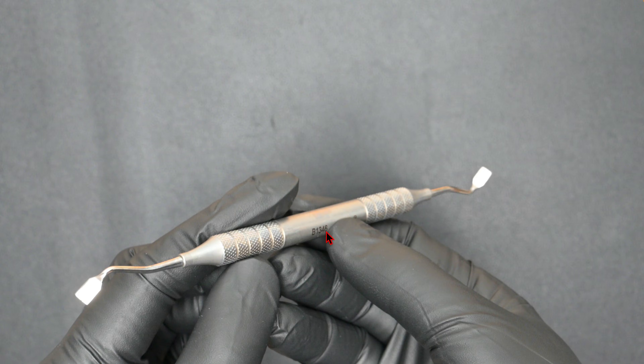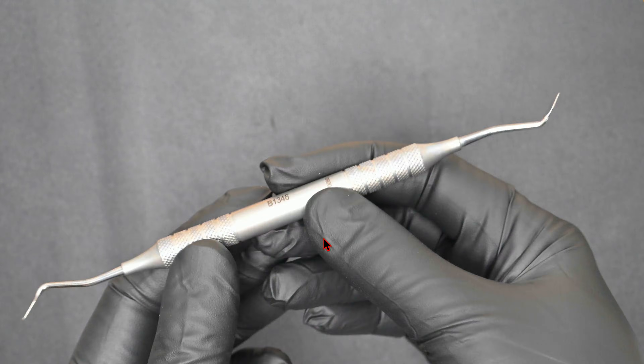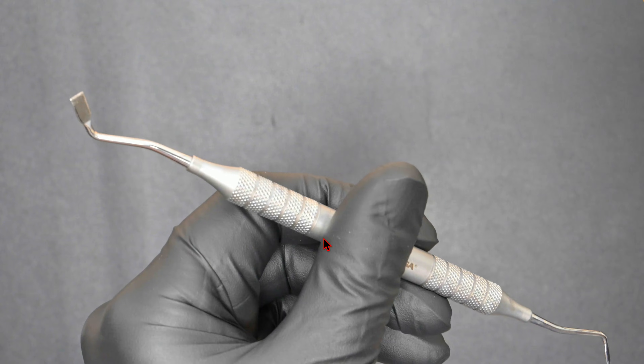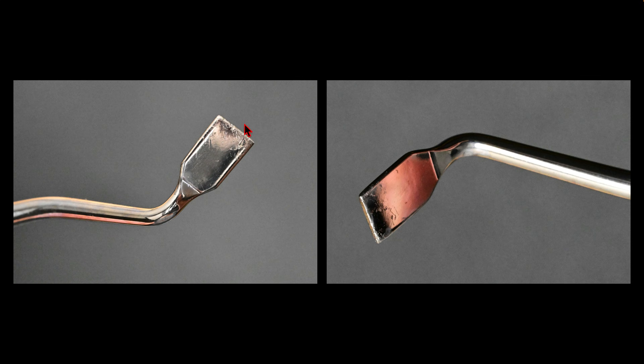Here's the instrument itself — it's a Brasler B1346. It has a really nice handle, it's not very heavy, and it's very strong and robust on the spreading sides with two different angles. These do get worn out over the years, and once you lose the sharpness to the tip you want to replace it because it won't work as effectively. The diameter is about perfect for a KS0 diamond to go in — there's room, but not too much. Too much space makes it less effective.